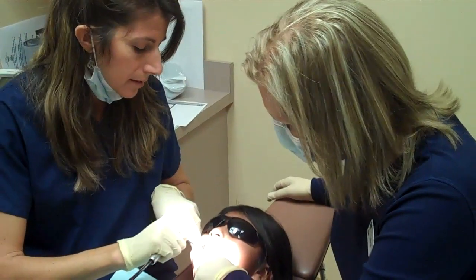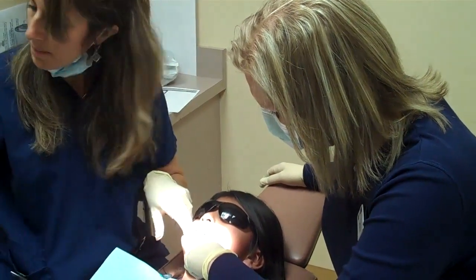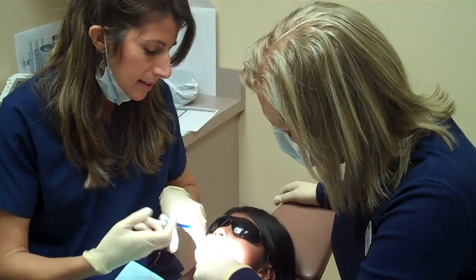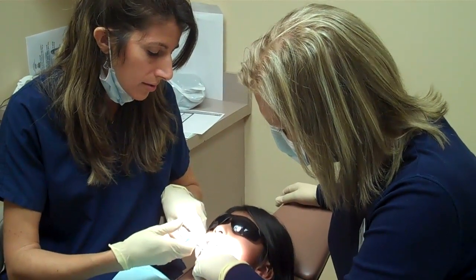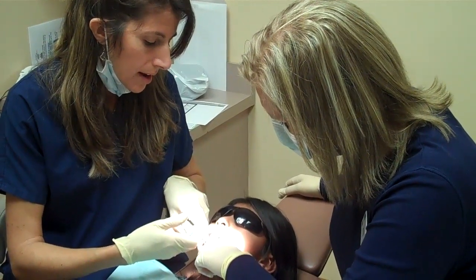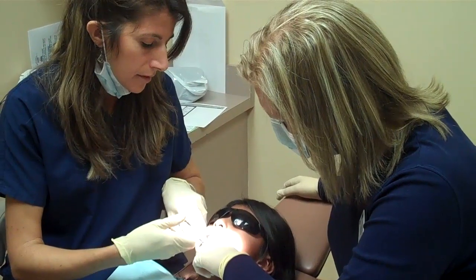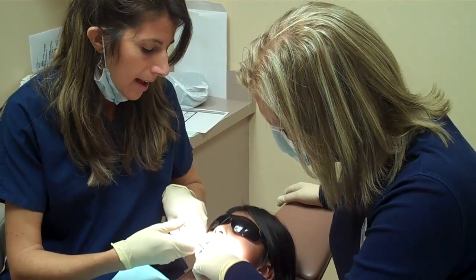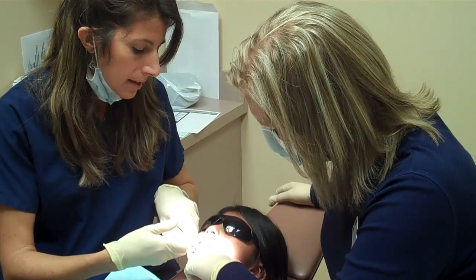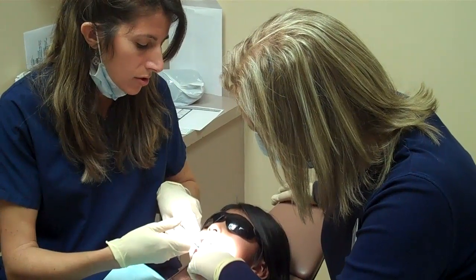First we're going to blow some air right on top of the tooth, and then we're going to paint on a little blue etch. What the etch does is it's going to roughen the tooth so that the sealant will stick. We guarantee our sealants for five years if the patient comes back every six months. And if they chip or break, we touch them up at their cleanings, but typically they stay on well unless the child chews on ice or has some habits of chewing hard things.